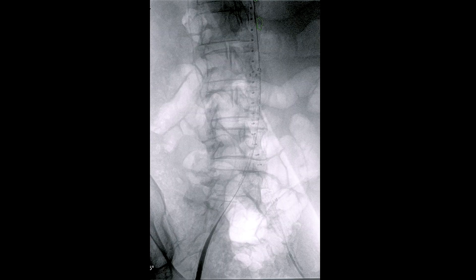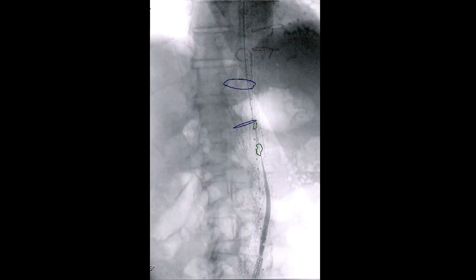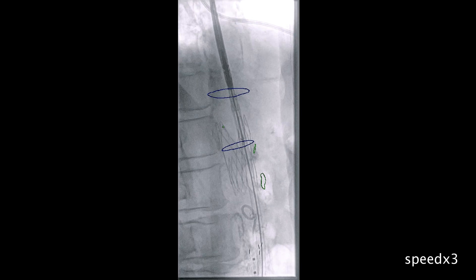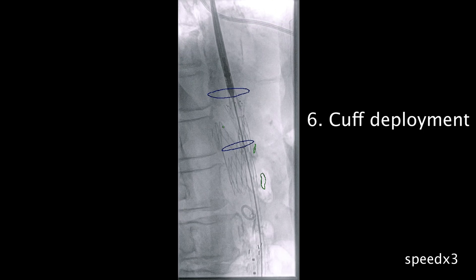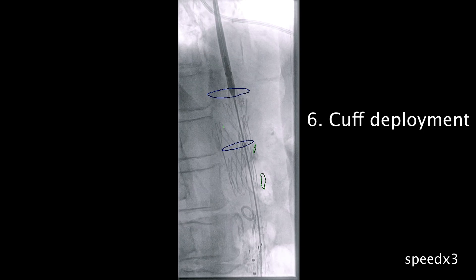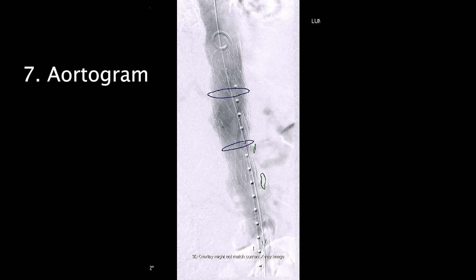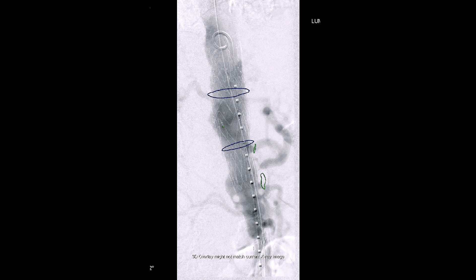Then, we introduced the 30 by 40 mm aortic cuff, positioned it between the marked blue zones and deployed it. As you can see, the device moved in the cranial direction, so we performed an aortogram which showed the bleb on the aorta was still filling, thus another cuff was required.